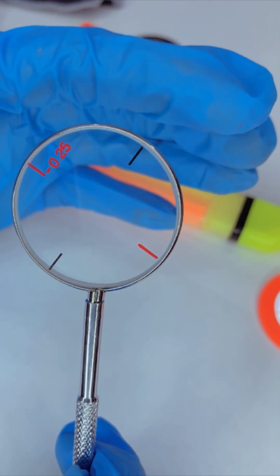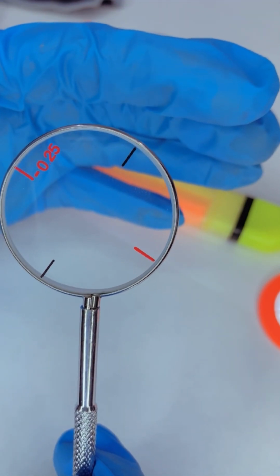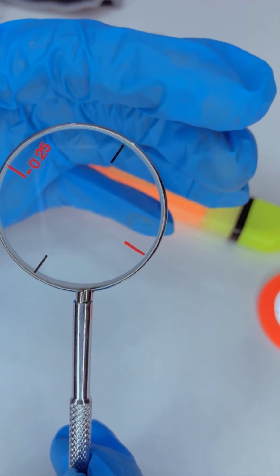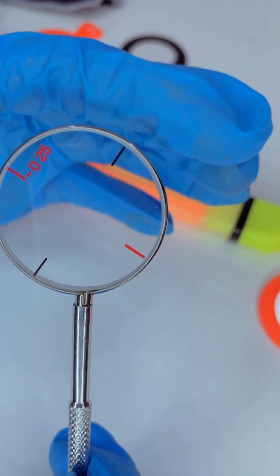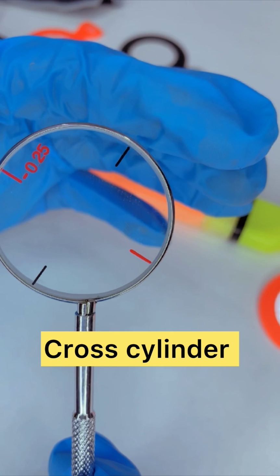Somewhere around 1907, Mr. Edward Jackson tried to modify that by also detecting the axis of the astigmatism using what I call the cross cylinder.